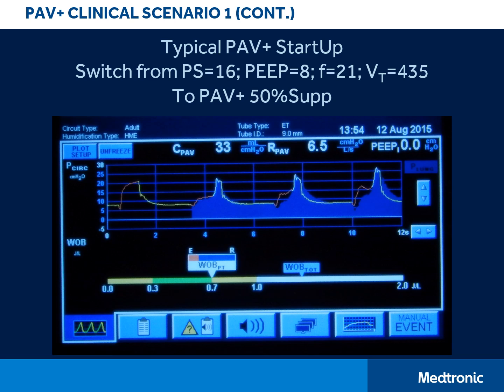Even though this was a relatively routine transition from pressure support to PAV, you are still likely to see more variation in tidal volumes during PAV ventilation due to natural biovariability that may be masked during pressure support ventilation.